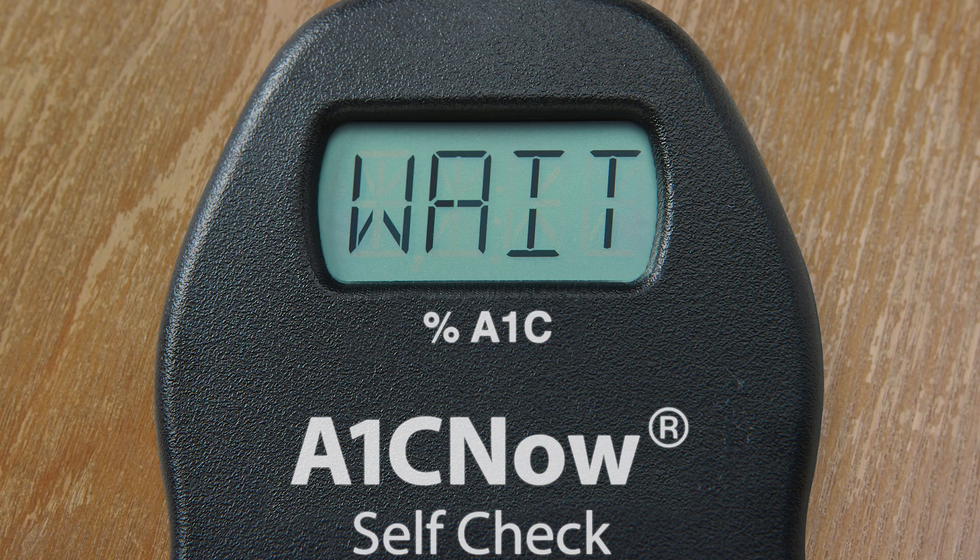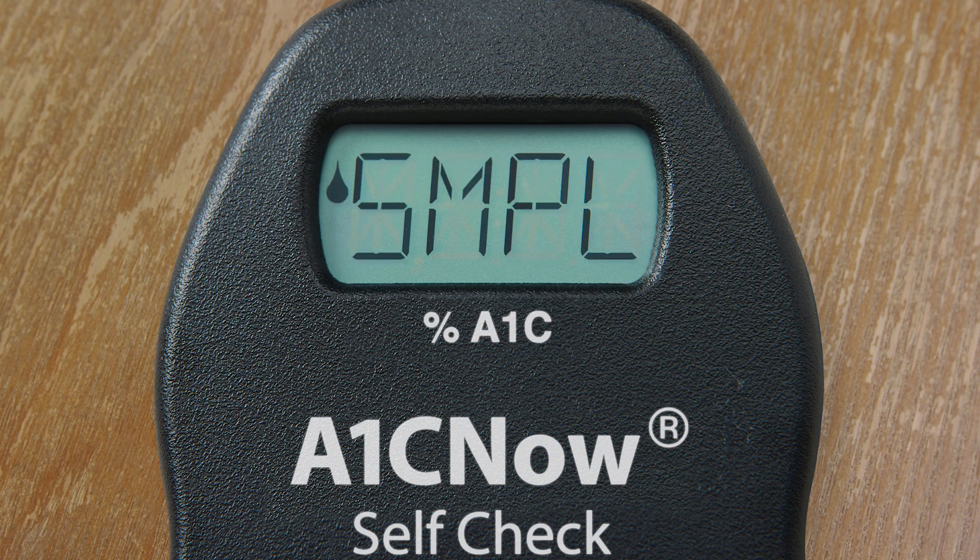After I insert the test cartridge, the analyzer first displays WAIT on the screen and after a few moments SMPL appears — that means we are ready to apply the sample. Next, pick up the shaker — that thing with your blood in it — and remove the bottom base, not the part where you inserted your blood sample previously; keep that part as it is. Make sure that your analyzer is lying flat on a level surface. Then dispense the sample from the shaker into the cartridge by pushing down completely into the white circle. Press down and remove quickly, then you will see RUN appear on the screen almost immediately after dispensing.